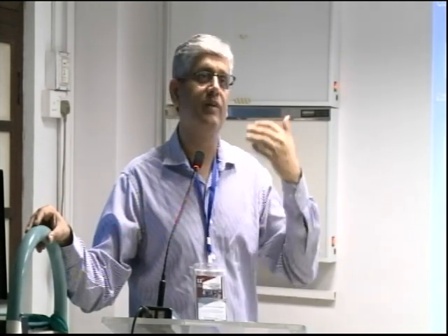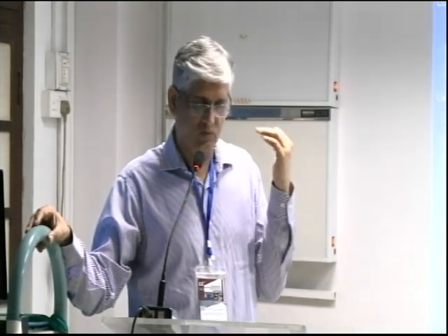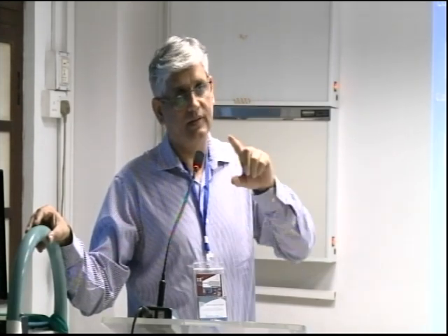5 minutes is actually low. 6 minutes is the minimum, but they say 8 to 9 minutes is what is really ideal, but 6 is the lowest. And that's basically based on the fact that when you're coming out is when you actually look, especially for smaller polyps. So it's that, and obviously safety and pain.